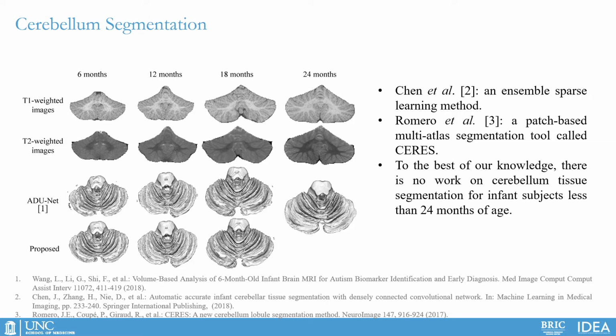We can see in the left figure, as the subject grows, the tissue contrast gradually becomes higher in the T1 and T2 weighted images, especially for the 24-month-old subjects, which are easier to obtain manual labels for.